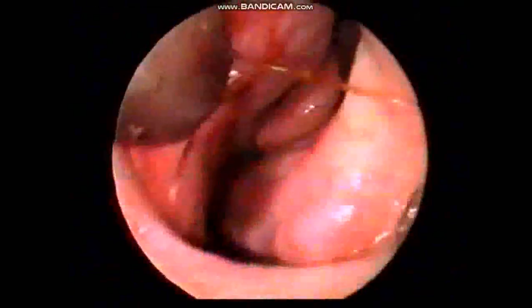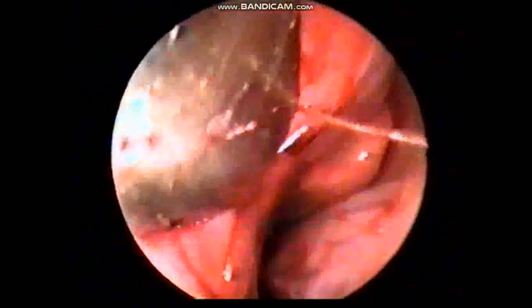One more similar suturing is done. I always put two sutures, one posteriorly and another anteriorly. There you can see the two stitches there.